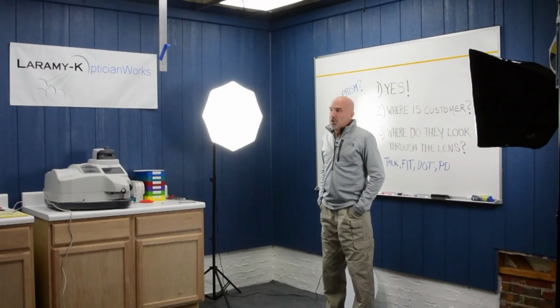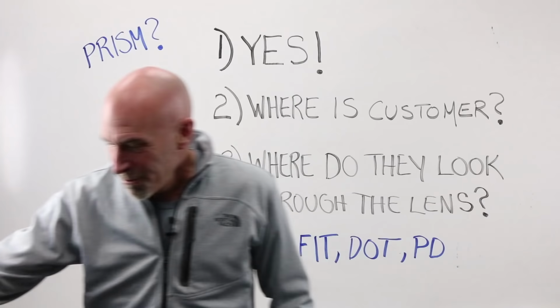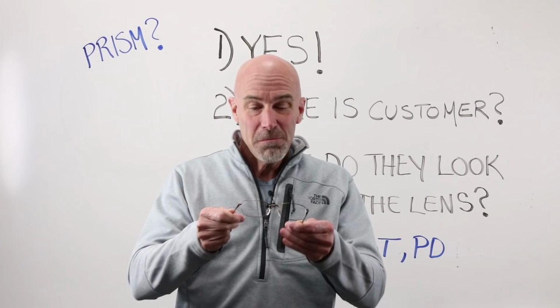I'm going to tell you what you should do, why you should do it, and then we're going to learn the steps and why we're doing those steps. The correct answer when somebody runs in and says, "Do these glasses have prism in them?" You can always say, "Yes."